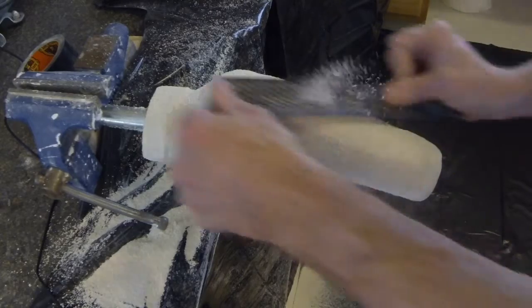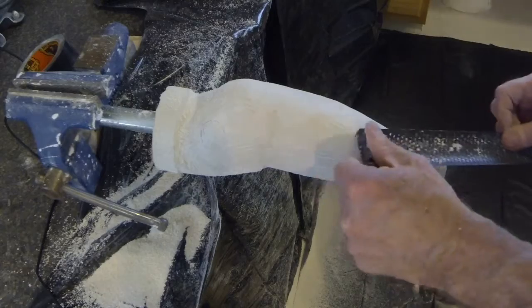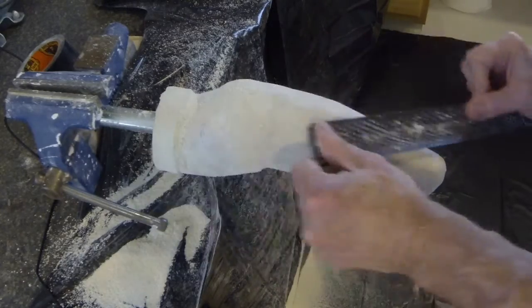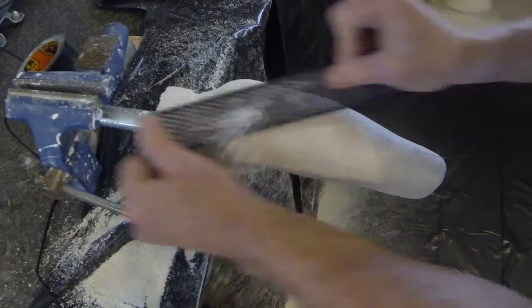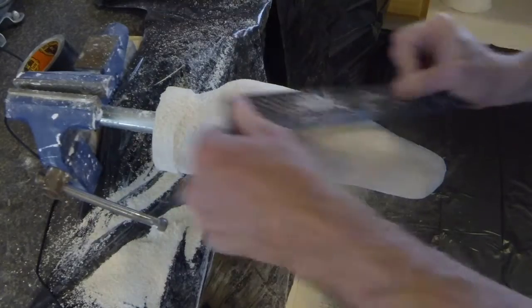Generally, no plaster additions are required along the aspect of the socket. In cases where there was roping of the plaster during casting, any of these very low points will be filled in with loose plaster later.